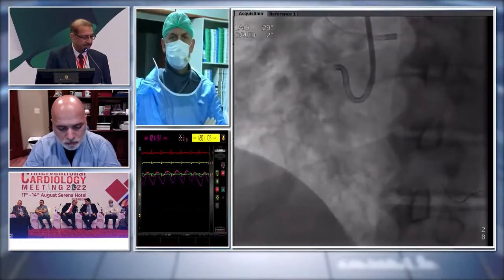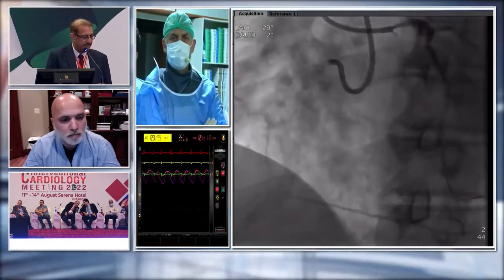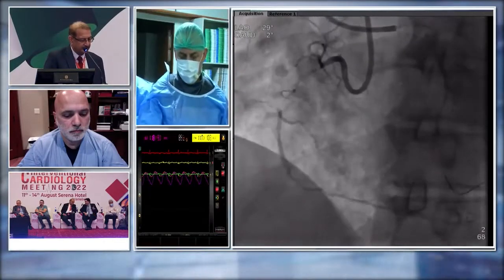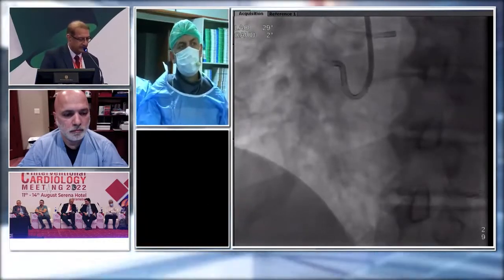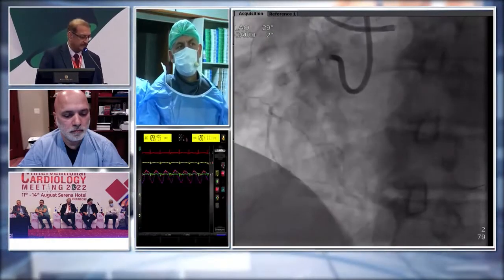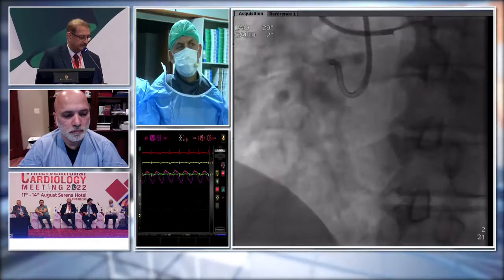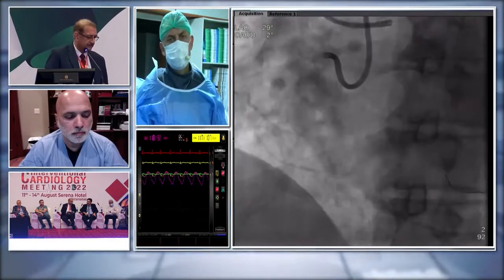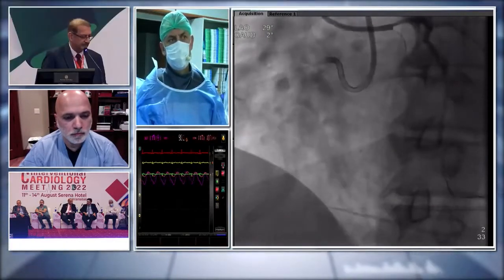First of all, sorry for the technical issues I had earlier this morning. It's nice to see all of you. Nice to see you, Omar. I agree with Omar. That's a short lesion, and this would never be helpful without the bilateral injections. So this clarifies the strategy. I agree with Omar to go with the antegrade approach from the get-go.